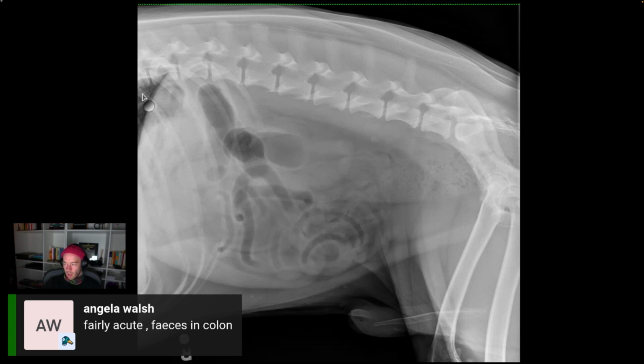Yeah, so Angela, I think you're referencing one of the things that I talked about, the acuteness of it. One of the things is the feces. Yes, there's fecal matter here in the colon and colorectal junction. But if the feces is very clearly formed and more normal looking, you can try to infer that it's more of an acute process. This is a little harder to do that because it looks like the feces is starting to be harder. I would describe this as incompletely formed or partially formed.